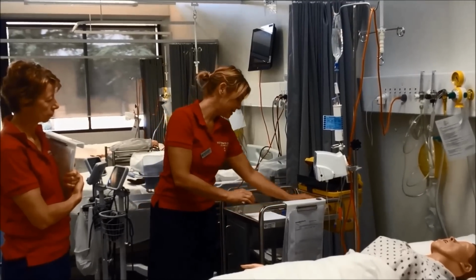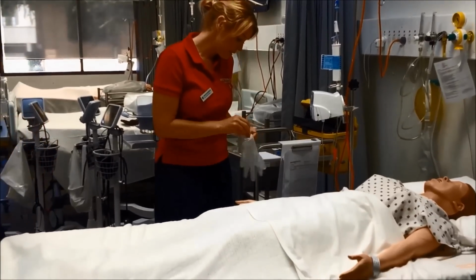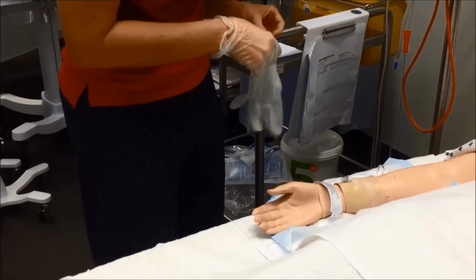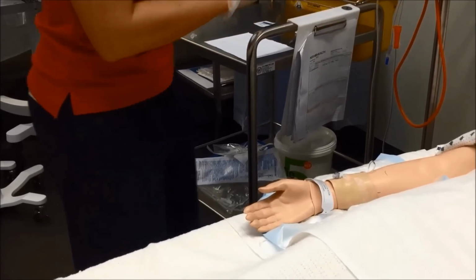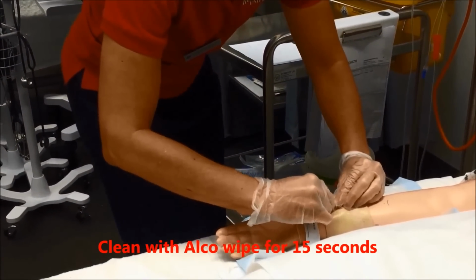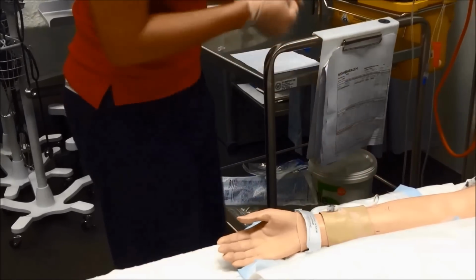Okay, now I'm just going to check his cannula site. How long has your cannula been in, James? Your notes say less than 3 days, yeah? Is it painful? Not painful? There's no redness, there's no swelling. That looks good. Excellent. Okay, I'm just going to give it a bit of a clean before I connect. Okay, 15 seconds. Excellent. That's not hurting, is it? No, good. Okie doke. All right, I'm going to turn on my pump.